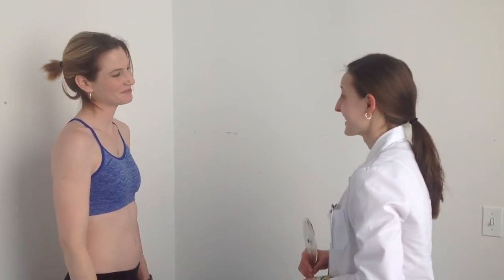All right, so normal is usually 180 degrees, so you're a little bit less than normal, but they both look even, which is what we want to see. Excellent. Looks good. Great.